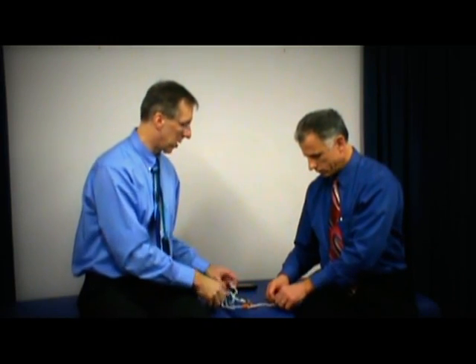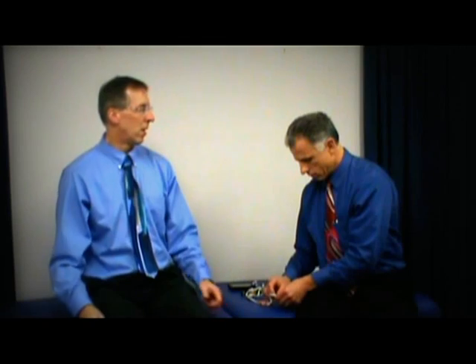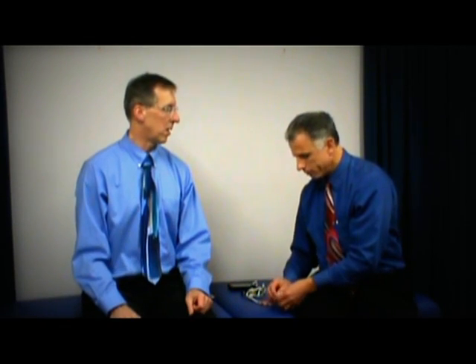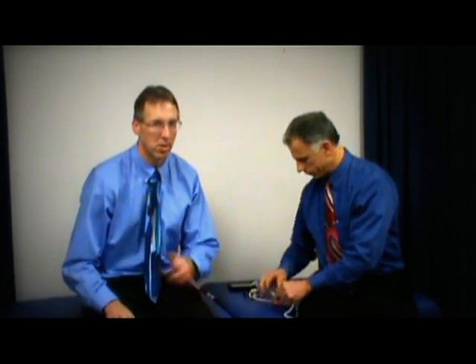So you got your pulley system, you hook it up over the door, make sure it's on a door that someone's not going to be coming through, otherwise you're going to get knocked in the head by your pulley. And I generally have people start off for a couple minutes, seeing how they're doing it. And the big thing when you're using the pulley system, you're really going to want to have good posture. You're going to want to emphasize being upright, because if you start going like this, you're going to start getting impingement at the shoulder. So you can start off with 2 minutes and eventually over time work up to even 5 minutes. And for people who are rehabbing, I even have them do it 3 times a day.